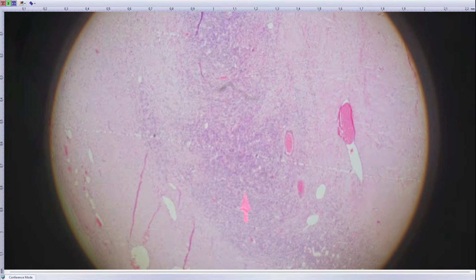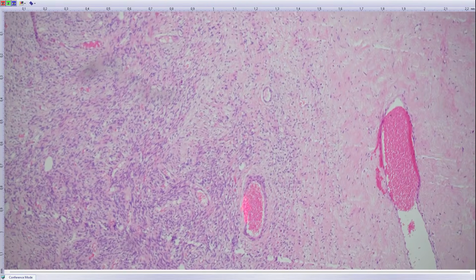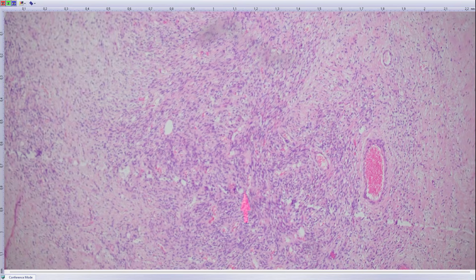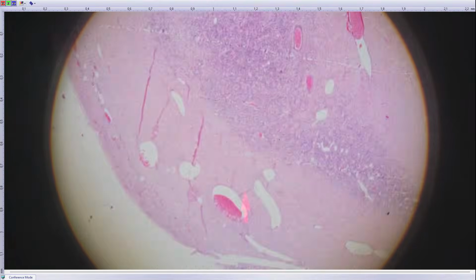Again, it is a completely benign tumor with prominent vessels, but in this case the vessels are more dilated, roundish, as you see here. And the stroma in between is more cellular. That's why it's called cellular angiofibroma. These tumors are usually CD34 positive, and they have RB1 loss and RB1 alterations by molecular testing. They actually belong to the spectrum of spindle cell lipomas, mammary type myofibroblastomas, and other RB1 altered soft tissue tumors.